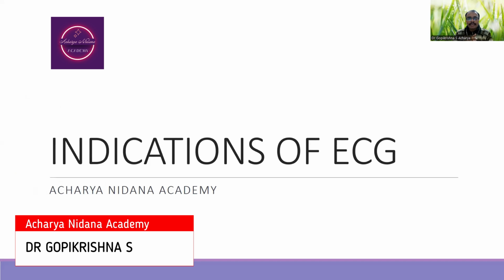So as far as the indications of electrocardiogram are concerned, first of all, we need to know what this electrocardiogram actually refers to. It is a diagnostic tool, an inexpensive tool, which is helpful in the diagnosis of cardiac diseases. From trivial cardiac disease, such as right atrial enlargement, to the most severe cardiac disease, that is myocardial infarction or acute myocardial infarction, otherwise called acute coronary syndrome.